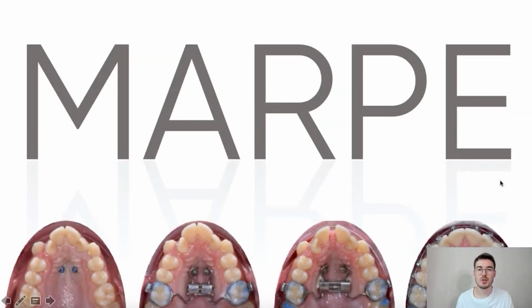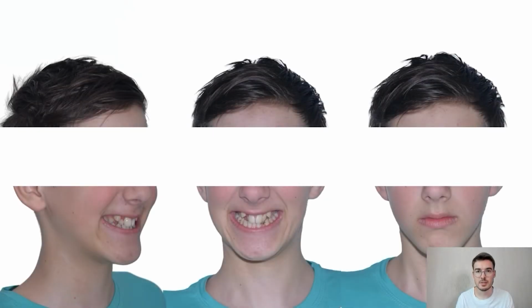Hi everyone, today we will analyze a clinical case in which we used Marpe. Here we have a 13-year-old boy. Let's take a look at the photos of his face. Even without intraoral photos, we can see that he has a narrow upper jaw.